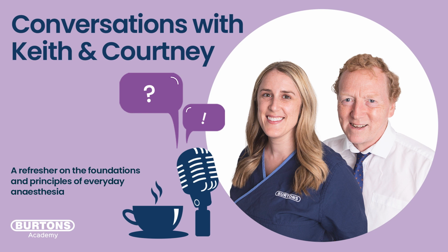So that's one of the reasons why pressure cycling is nice, particularly when you get down to those smaller animals, your 200-300 grams, where you're calculating a tidal volume of around a mil or two. If you get that calculation wrong because the weight is wrong or it's obese or whatever, you could be delivering a volume that gives you a higher than expected pressure.